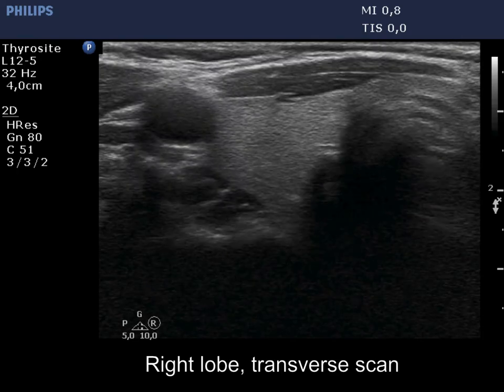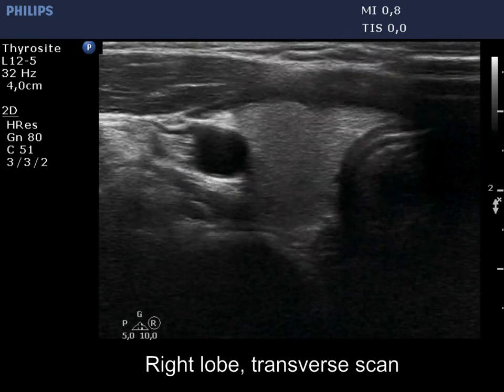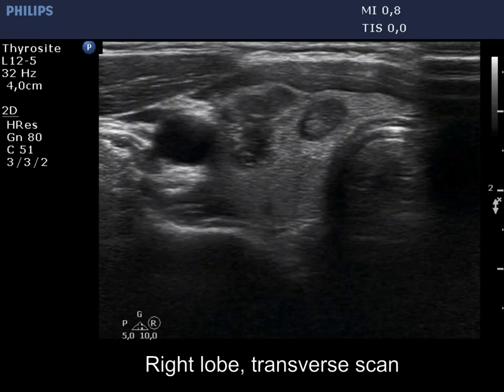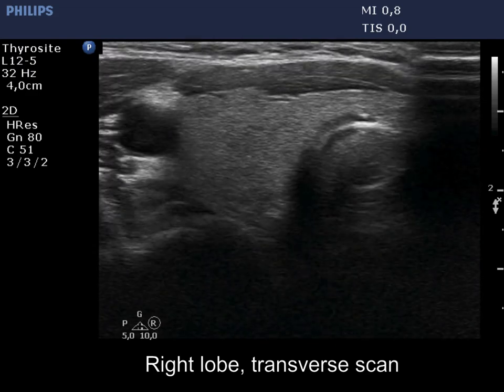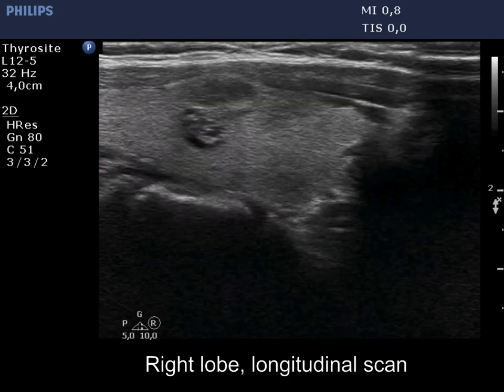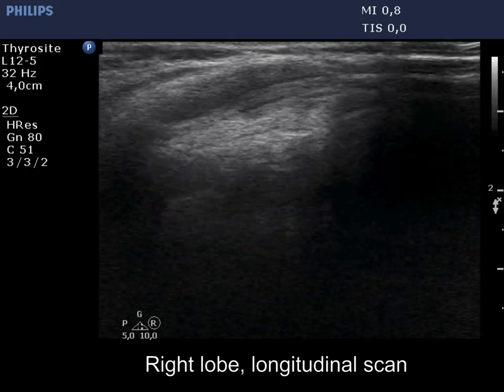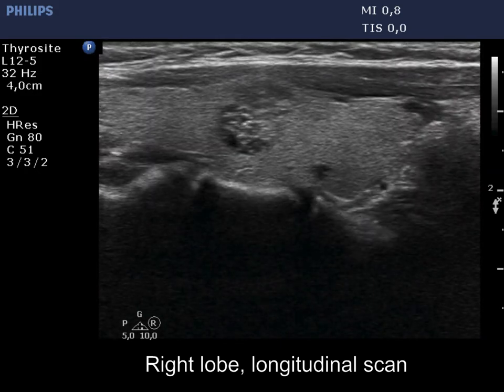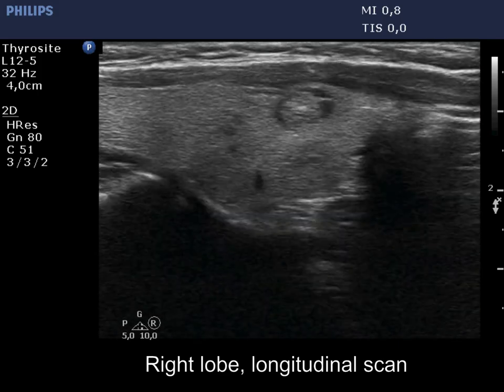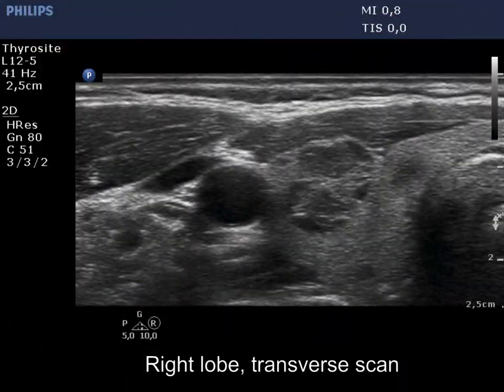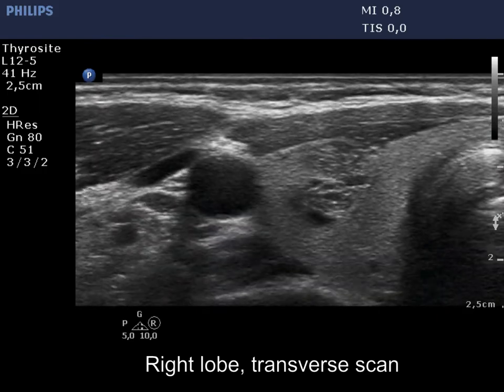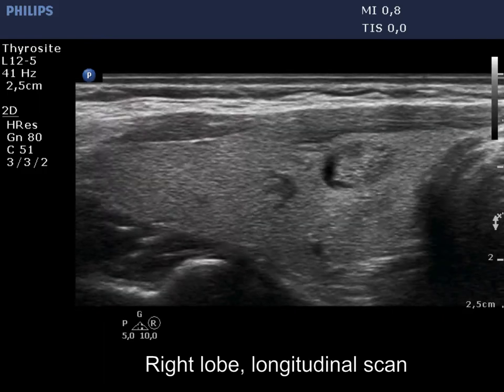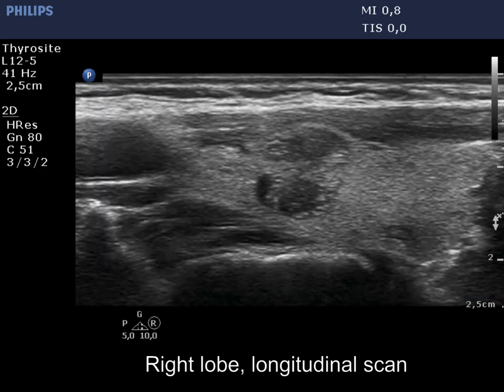The first example presents a multinodular goiter with multiple solid nodules showing cystic degeneration. These are dominantly solid nodules which show multiple echogenic lines and granules, partly related to ventral cystic areas. On enlargement, the presence of tiny cystic areas ventral to echogenic lines is more evident. These figures are caused by back wall posterior enhancement.